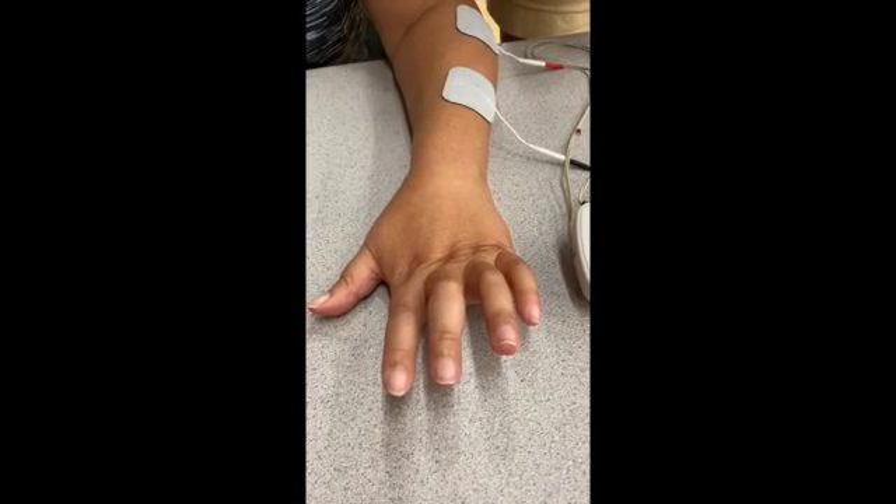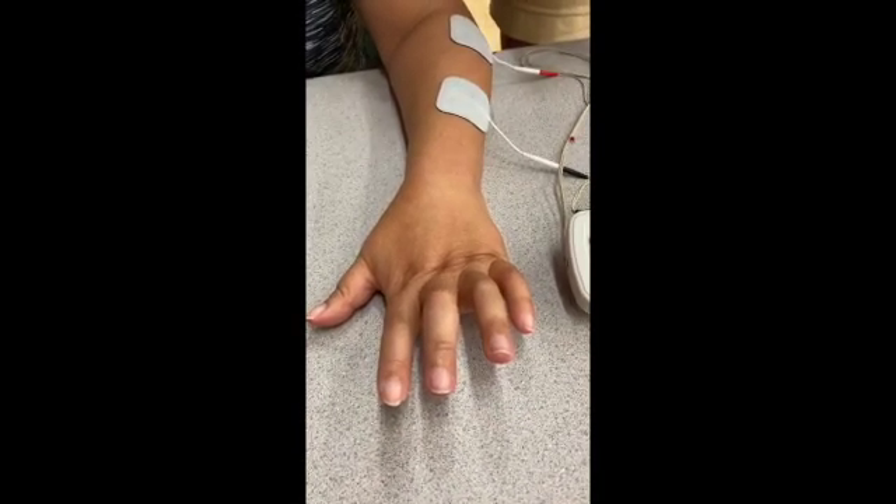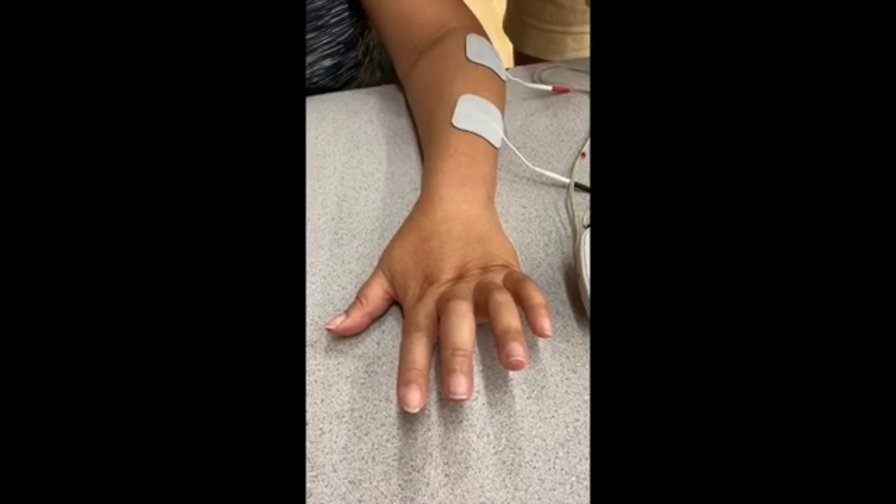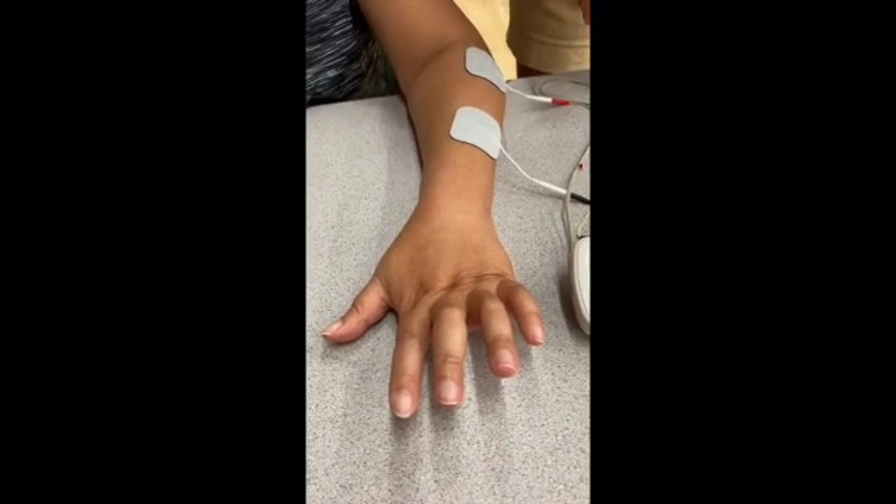You may need to turn up the intensity depending on the person. The use of e-stim, particularly for finger extension, can help with functional activities that involve release of objects.